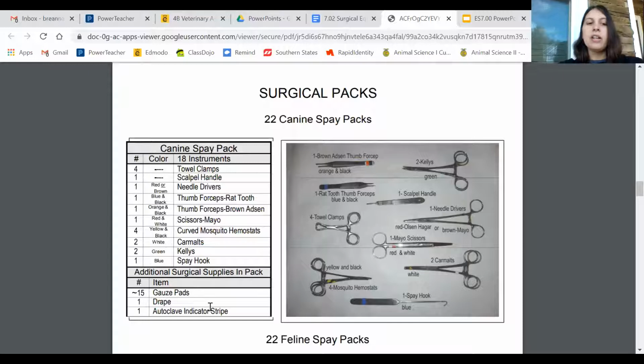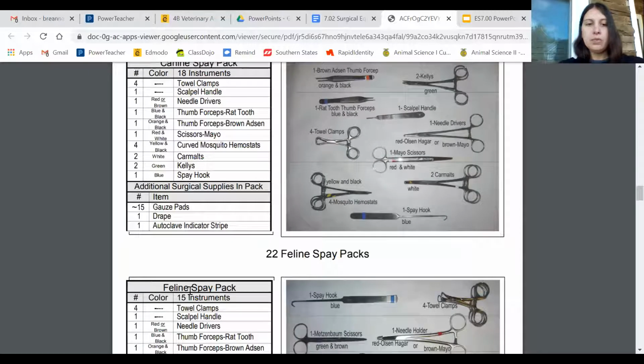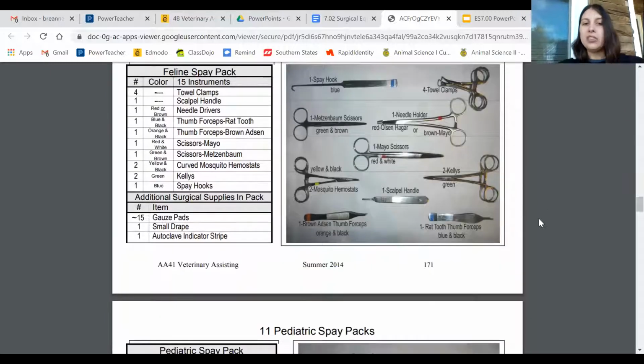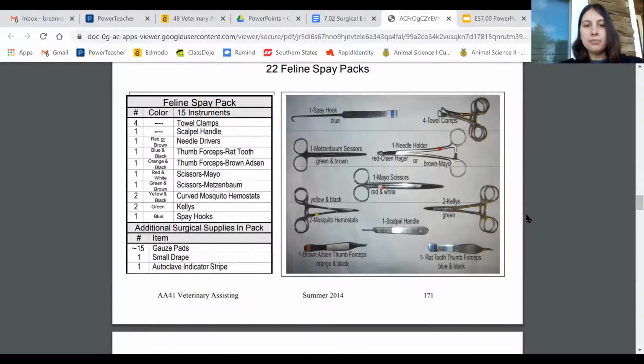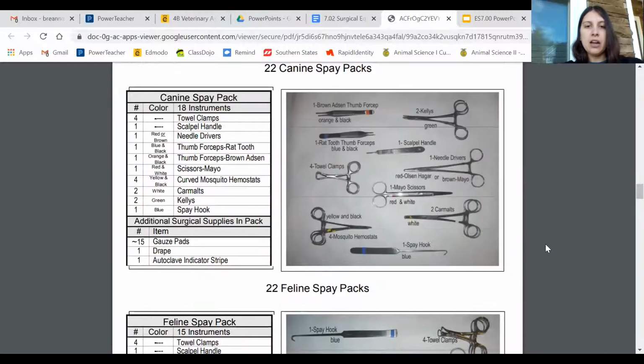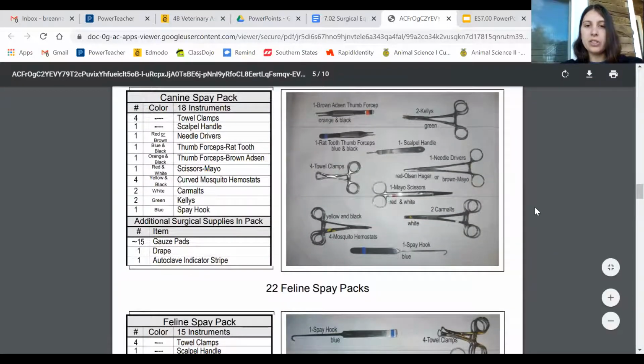You're going to need a drape. You're going to need autoclave tape. You're going to need some gauze. So just so you can see how many different things you're going to end up needing. You can see all the different kinds of scissors that are going to be needed. You can see different forceps.